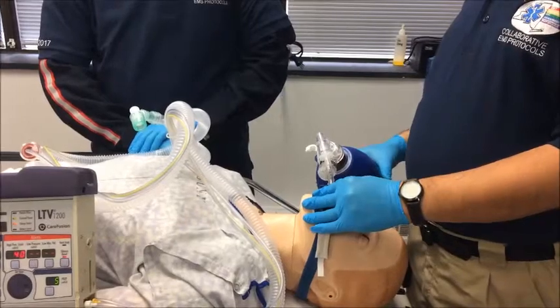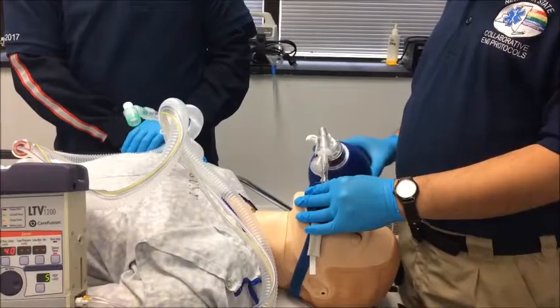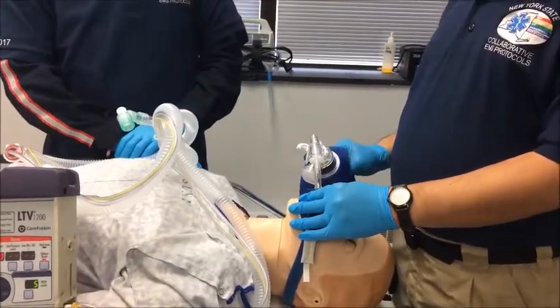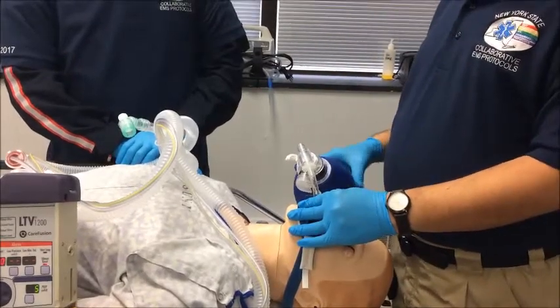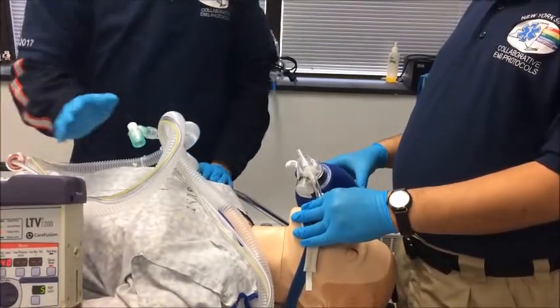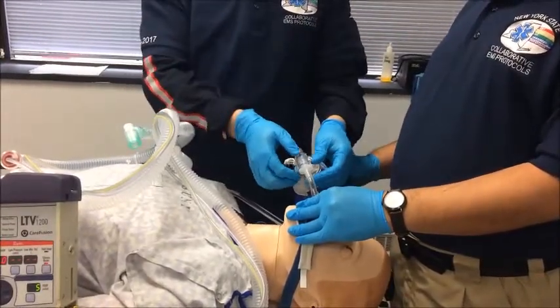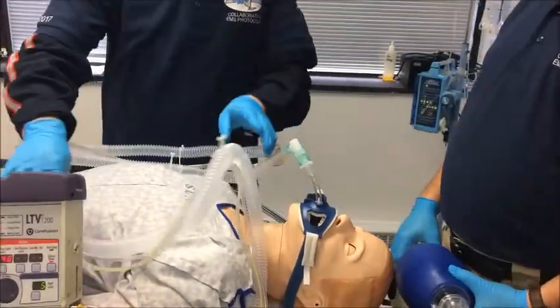Whenever you're using the transport ventilator, it's very important to make sure that you keep your bag valve mask readily available. Not only the BVM itself, but also the mask in case your endotracheal tube gets dislodged, and then the BVM in case there is any problem with the automatic transport ventilator. So now that we have our settings, we're going to transition the patient from BVM mask ventilation over to our ventilator. So we're simply going to make sure the tube or advanced airway is supported. We're going to disconnect and immediately connect our ventilator to the patient.